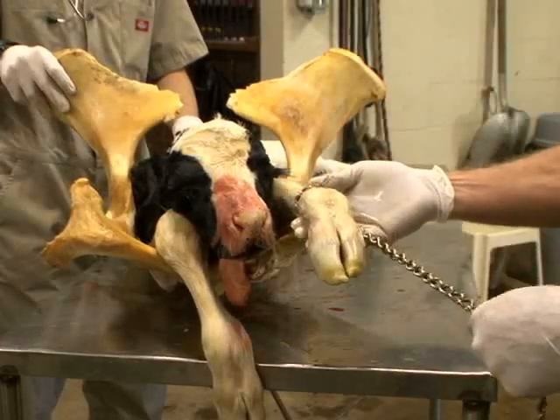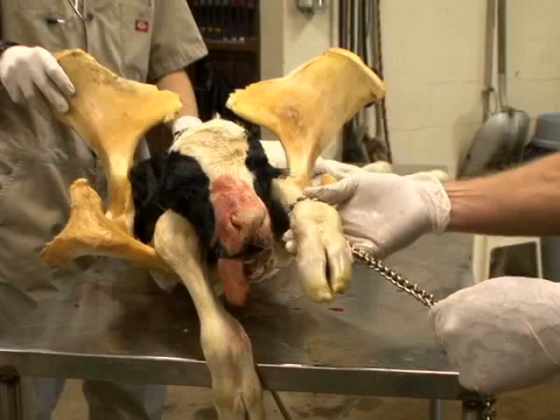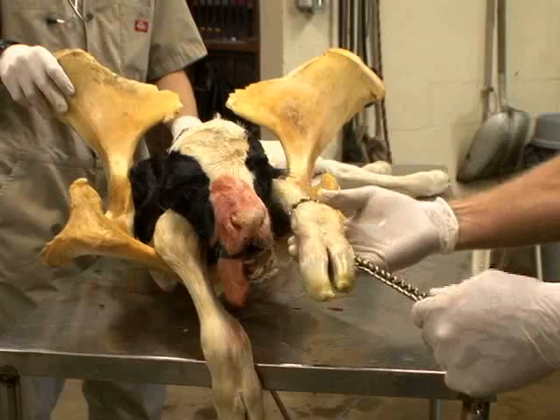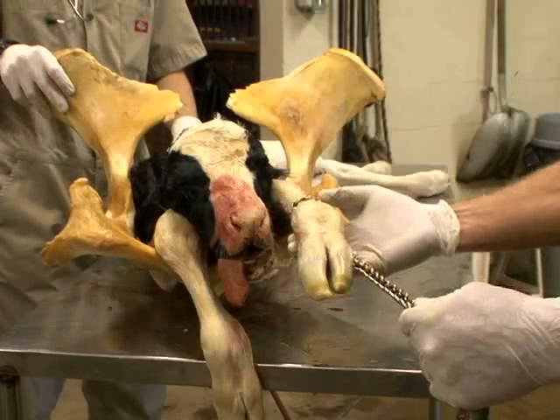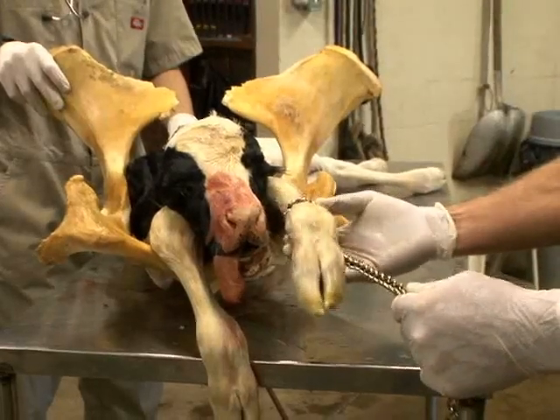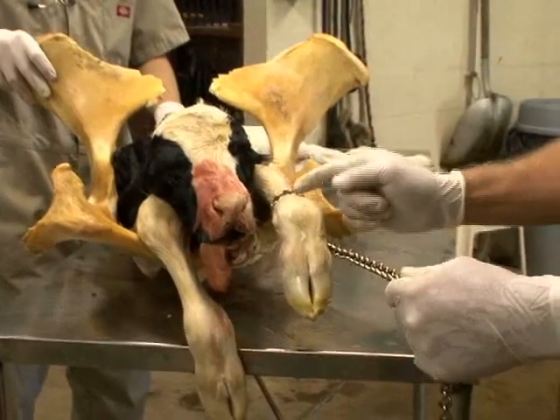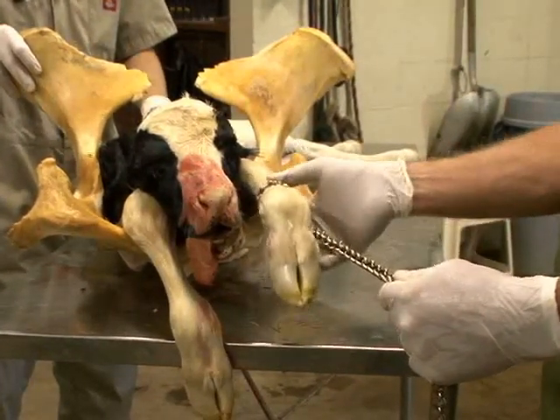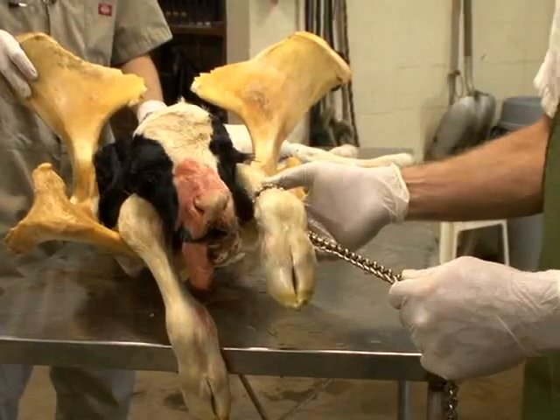If you elect to pull on the chain at this point, that would be a very bad thing to do, because if you pull with force on this chain only, there is a lot of pressure applied to this area and you could easily break the metacarpal bone of the calf.